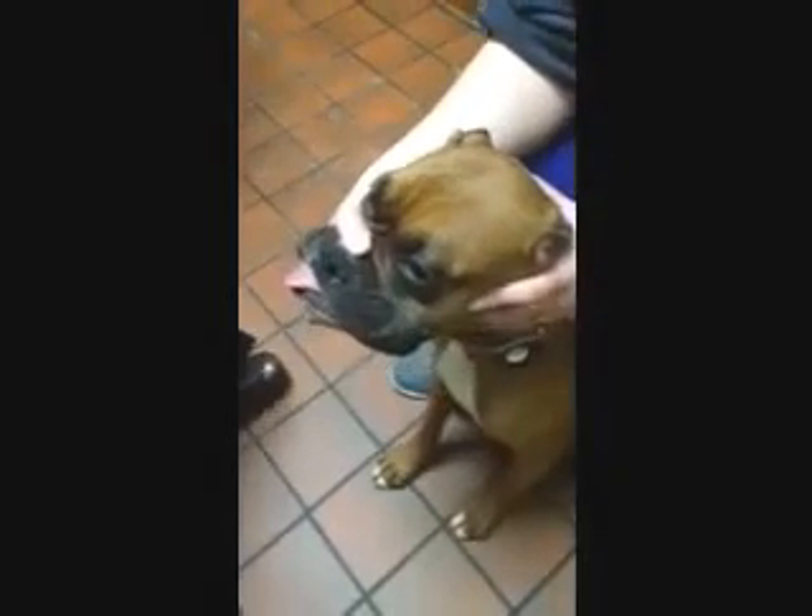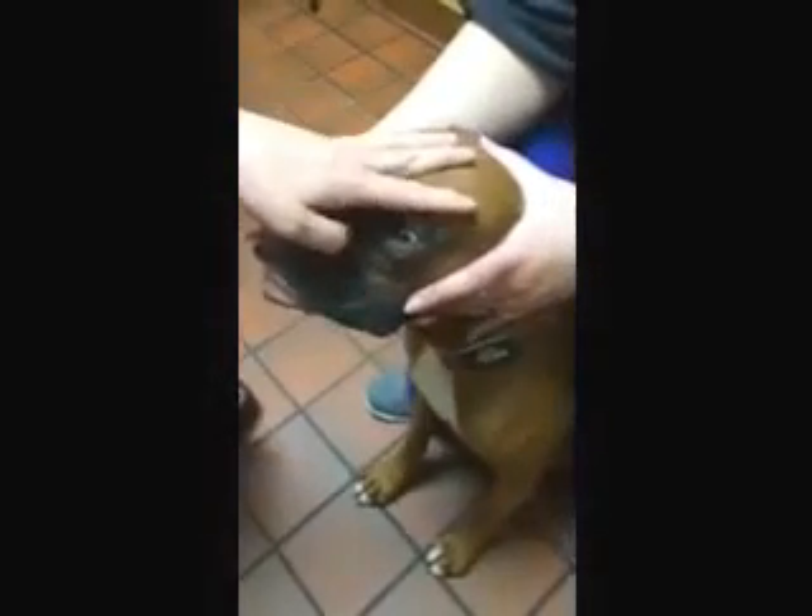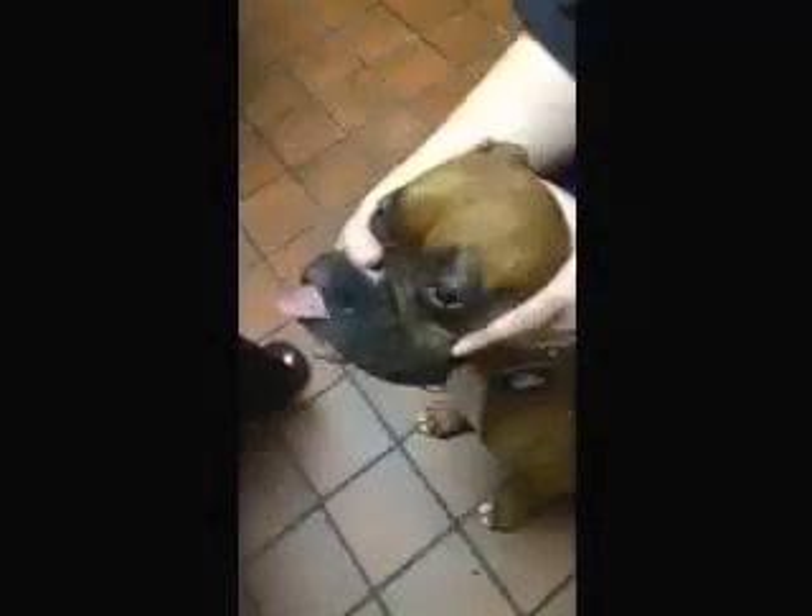This is Bailey, and Bailey's going to help us perform the proper technique for conjunctival scraping. First, I'm going to put a drop of topical anesthetic — in this case proparacaine — on the surface of Bailey's eye.